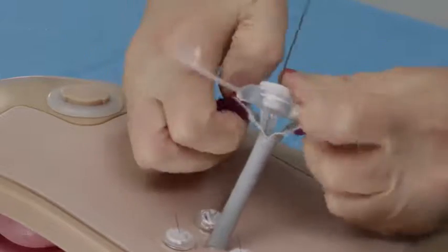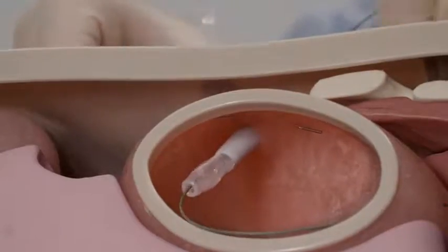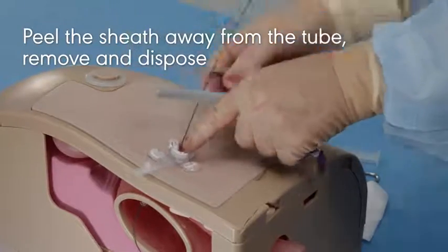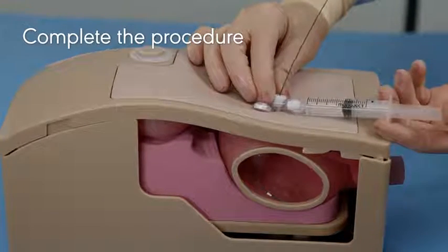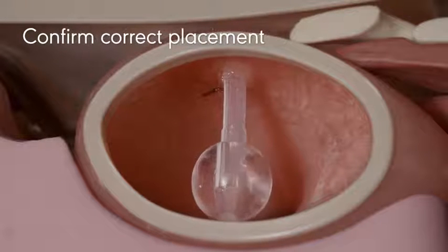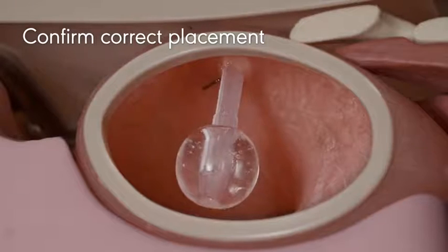After the tube has been advanced through the peel-away sheath and is in position in the stomach, peel the sheath away from the tube and remove and dispose of it according to facility protocol. Complete the procedure according to the Avenos MIC and MICI brand enteral feeding tube instructions for use. Confirm the enteral feeding tube is positioned in the GI tract prior to feeding.